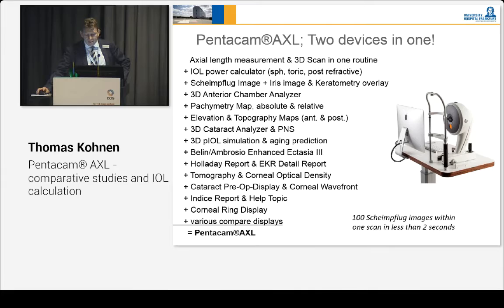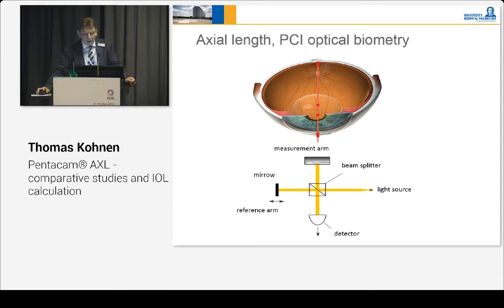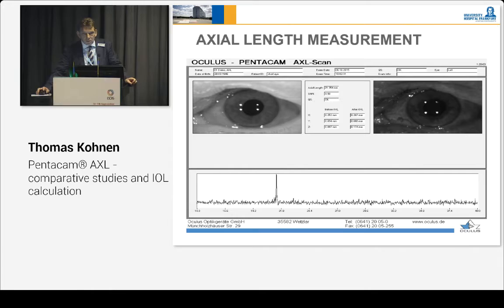The Pentacam AXL takes 100 Scheimflug images within one scan in less than two seconds for all this information. Now, important for us is if you look at axial length measurement — we are all aware of the PCI optical biometry, partial coherence interferometry — and you can see how that is done. This technology from the IOL Master is now measuring worldwide as a standard the axial length.